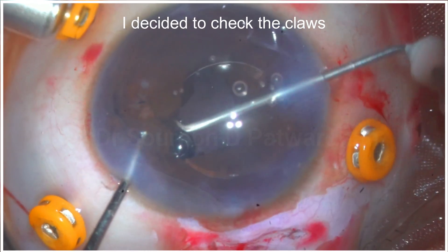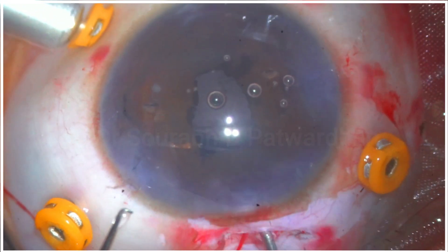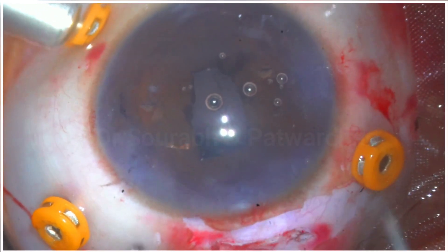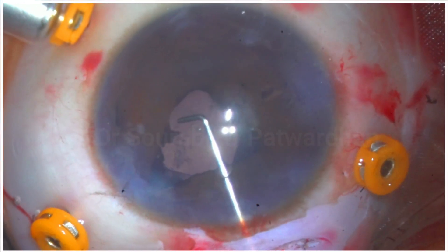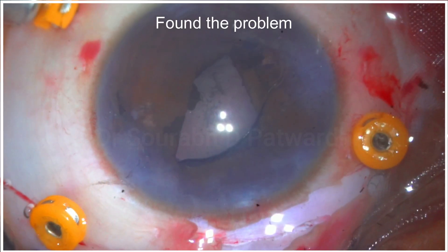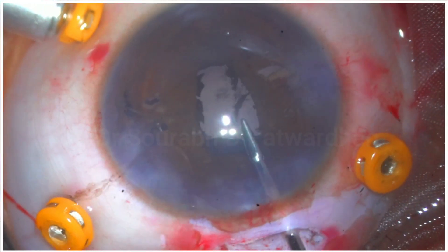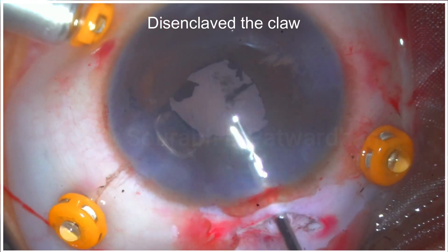I couldn't judge where I should press to enclave the iris into the claws, so I investigated further. When I checked the claws on the other side, I realized there was no claw at the center of the haptic. When I retrieved the second haptic, I could see there was no claw on that side either — at least not visible to me.